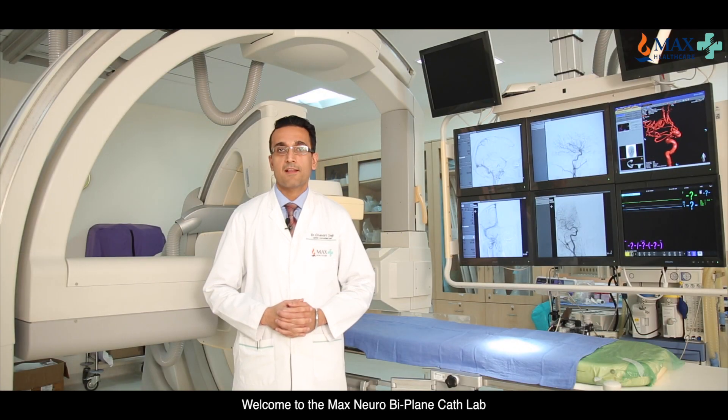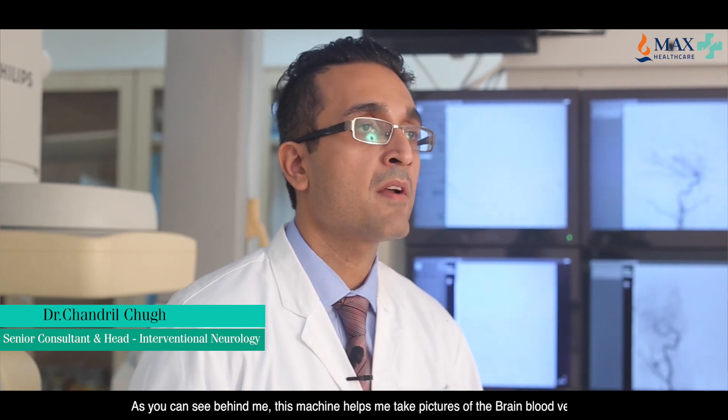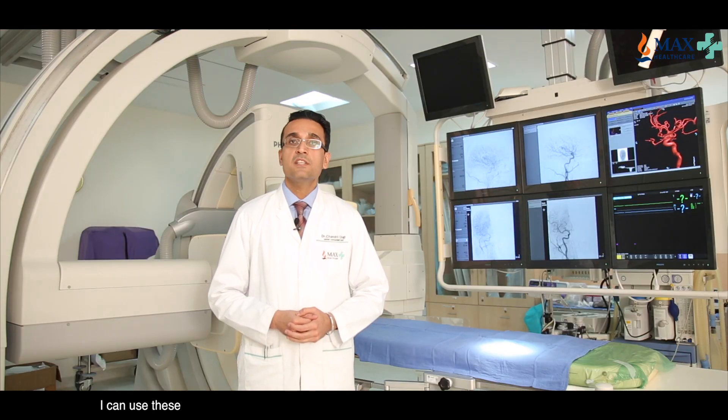Welcome to the Max Neuro Biplane Cath Lab. As you can see behind me, this machine helps me take pictures of the brain blood vessels in the frontal plane as well as from the sides.